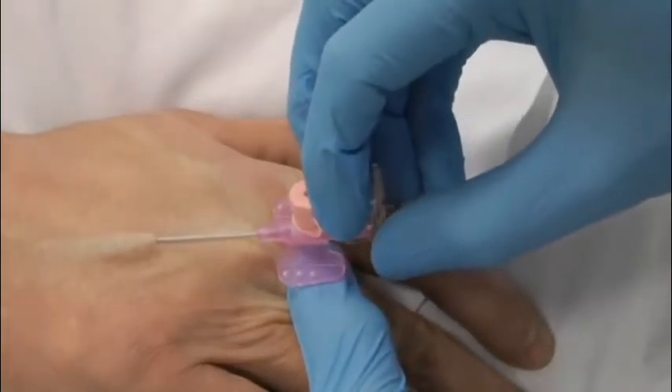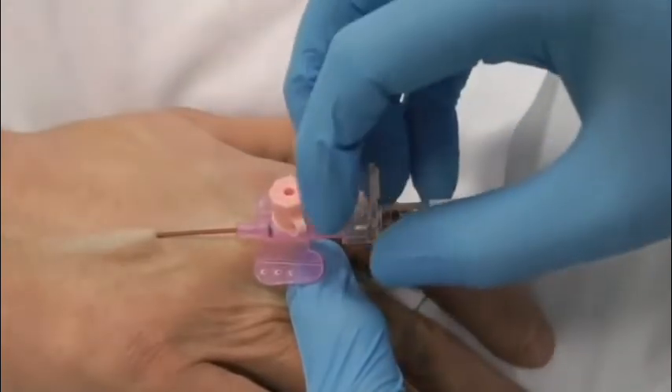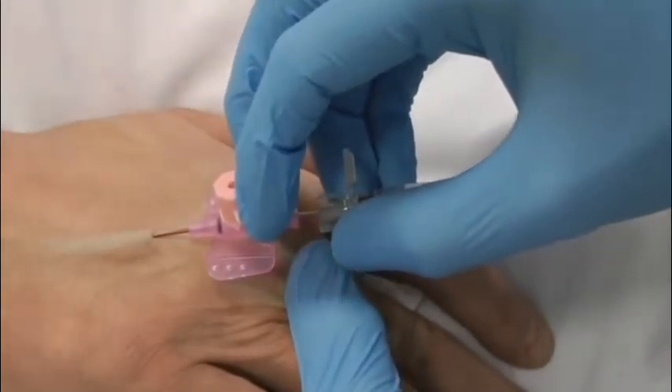Advance the cannula slightly. Then, stabilising the needle, advance the catheter. Note the second flashback. Fully insert the catheter.